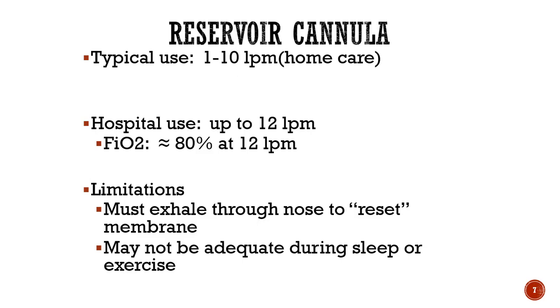So definitely don't focus too much on those, because although the manufacturer has them as a liability clause, when you are talking about someone whose lung health has deteriorated to the point where they need a reservoir cannula or oximizer to be able to go home, there's a lot of things that you are just going to accommodate that might not fit perfectly into those boxes. And for exercise, typically speaking, COPDers that are on oximizers have a lot of dyspnea with exertion. They seem to work fine, if they qualify.